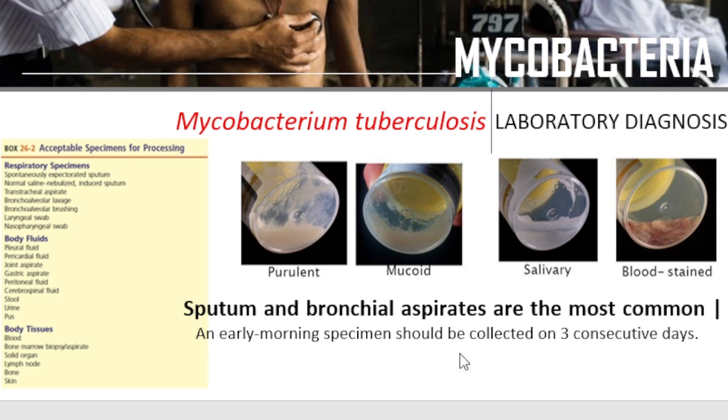the sputum test procedure is a cornerstone of diagnosing respiratory diseases through laboratory analysis. Accurate sputum sample collection is essential to avoid false negative or inconclusive results that could delay treatment or lead to inappropriate care. So by ensuring a clean, adequate sample, patients and doctors contribute to better treatment outcomes.